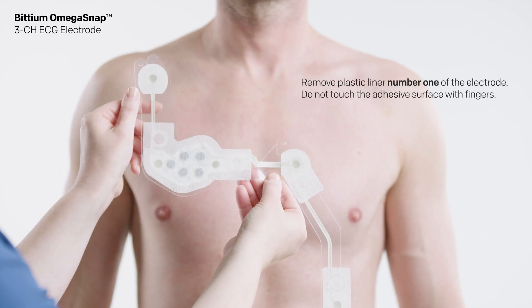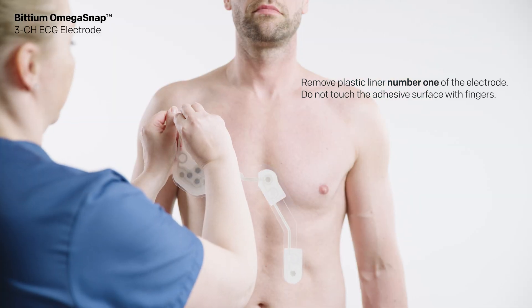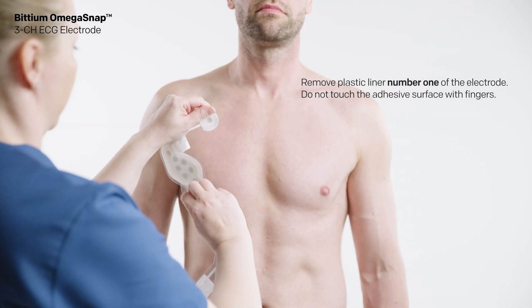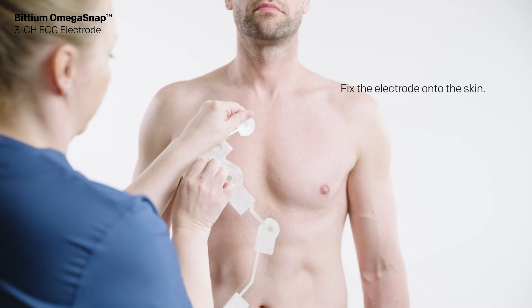Remove the plastic liner marked with number one from the electrode. Do not touch the adhesive surface with fingers.